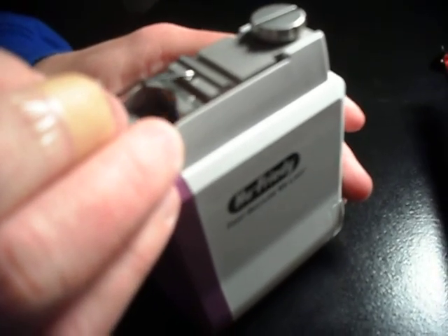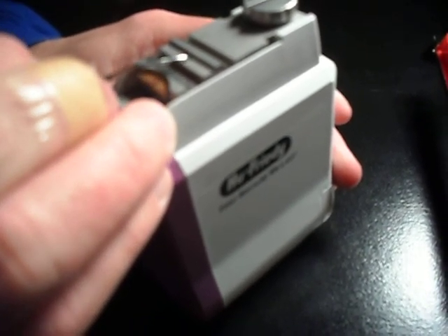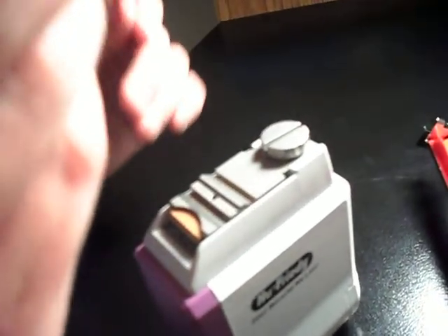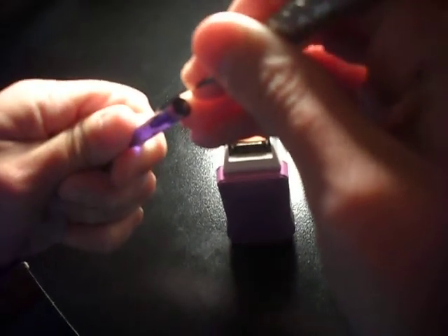And turn it 1, 2, 3 times. See? And then you just round off the toe. And then you take the bite stick and you make it bite. And we know it's sharp. And that's how you sharpen dental hygiene scalers and curettes.